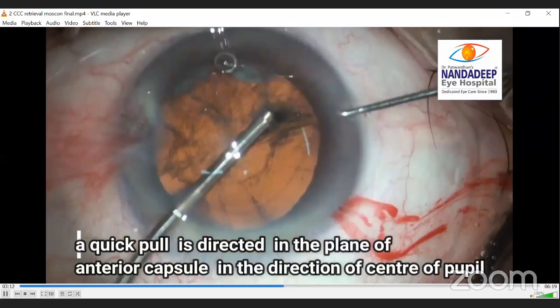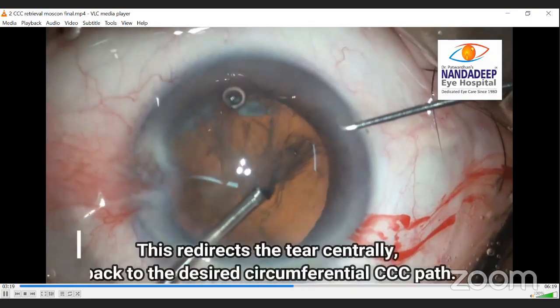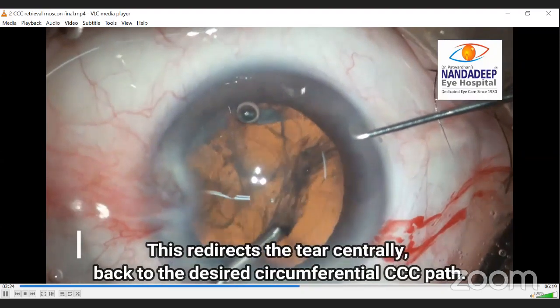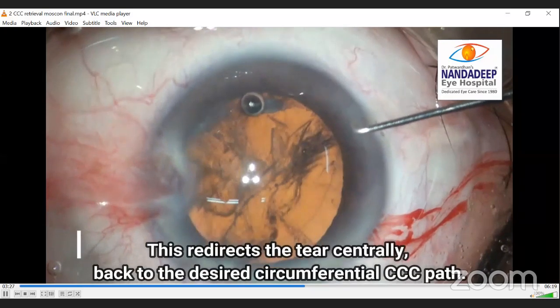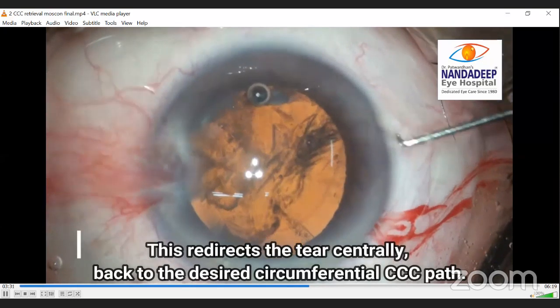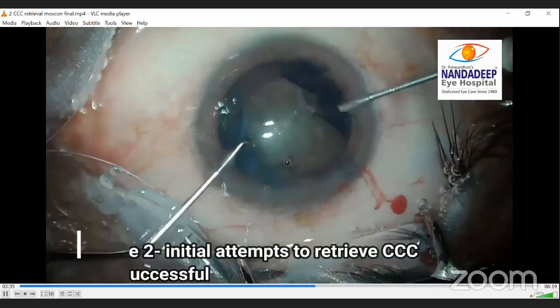If you try to pull it very slowly, it tends to extend even further. So it has to be done with certain speed so that it comes back and you get a complete Capsulorhexis. We'll see again in another case. Now watch here how to exactly do it.